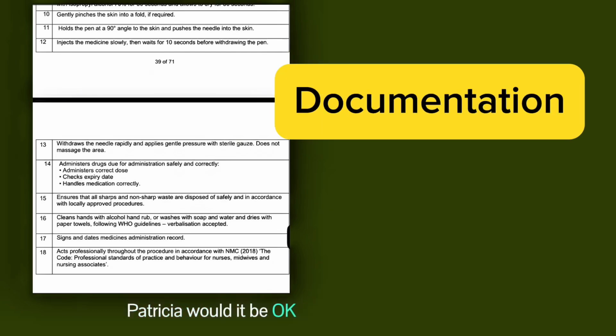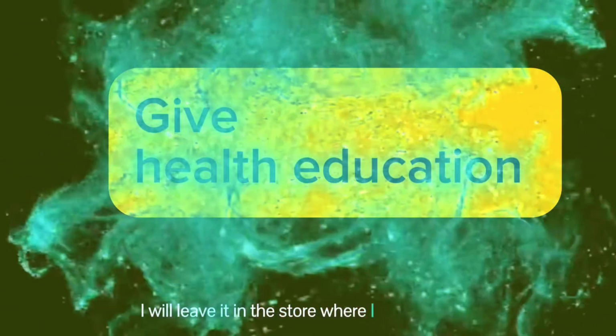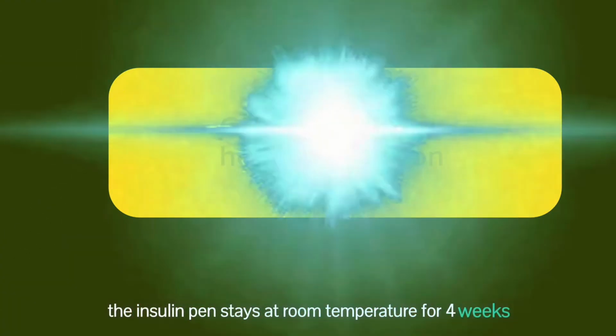Patricia, would it be okay if I just document for a bit? Patricia, here I give you your insulin pen. I will leave it in the store where I got it from. Just for your knowledge, the insulin pen stays at room temperature for 4 weeks.